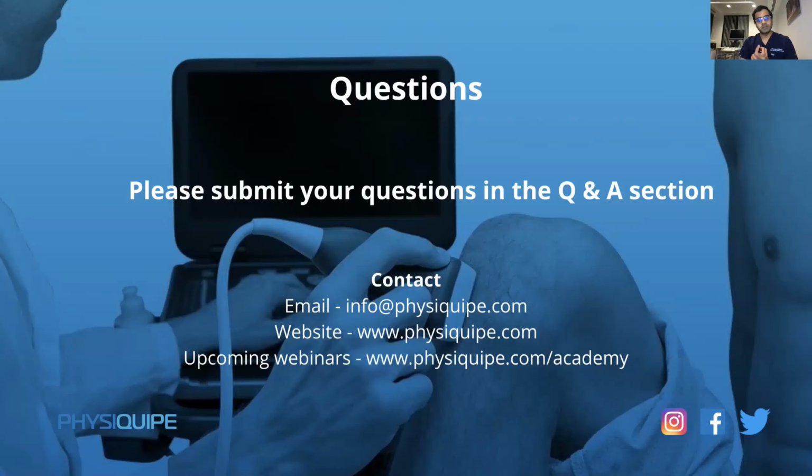Yeah, so I'm just trying to read your question there in terms of MSK ultrasound and the glenohumeral or shoulder joint. Though ultrasound is very good at assessing the soft tissues and the rotator cuff tendons, it is not the right imaging modality if you're trying to evaluate what's going on within the glenohumeral joint proper. So if you're looking to see if there's any underlying chondropathy, or in the context of arthritis, ultrasound is not the go-to imaging test.